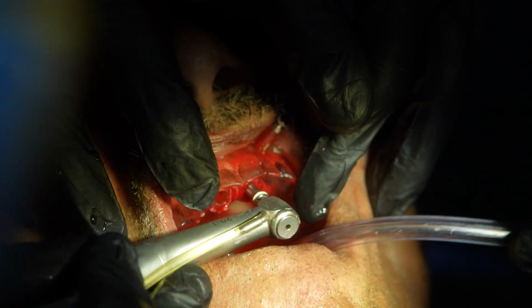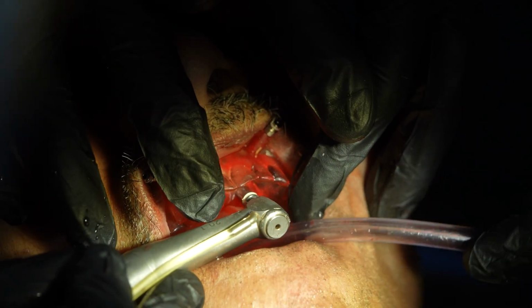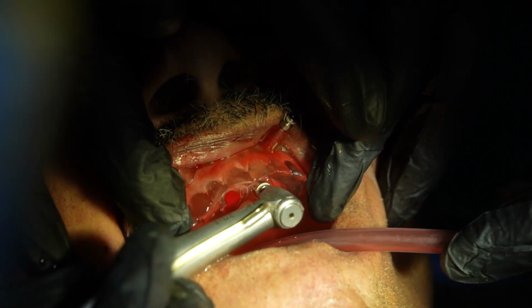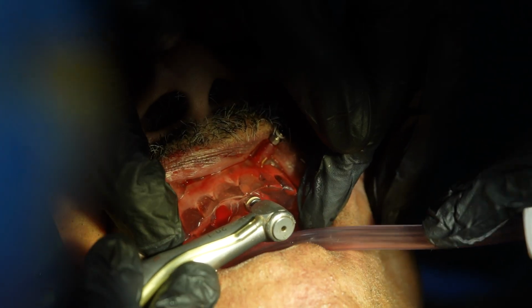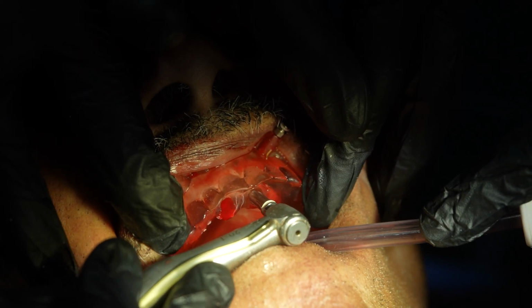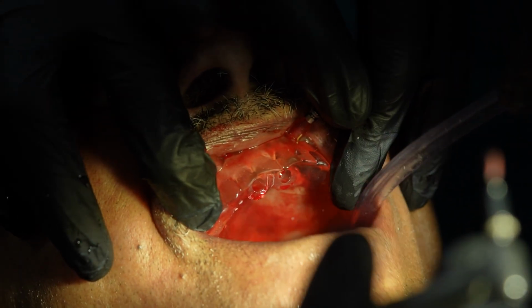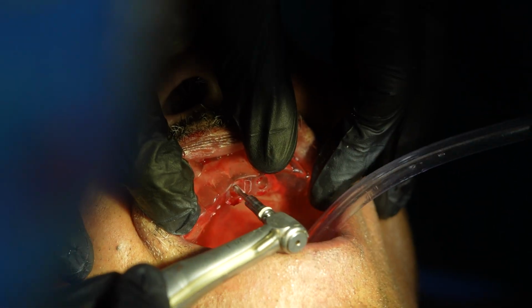Okay. Blue needle. So you can see the bone which is present. So we are going within the bone. I am going in the second part.